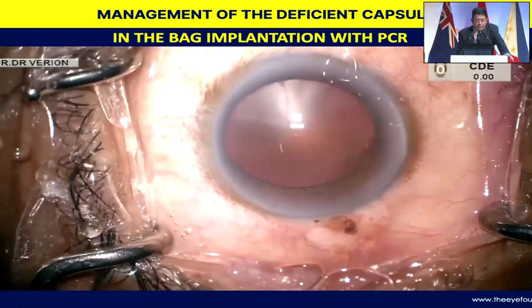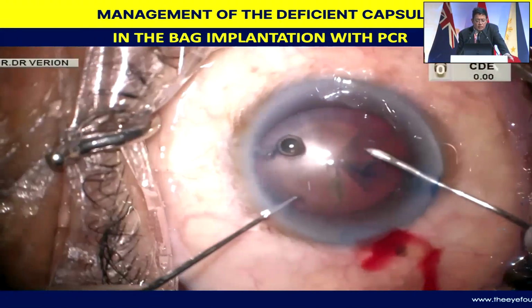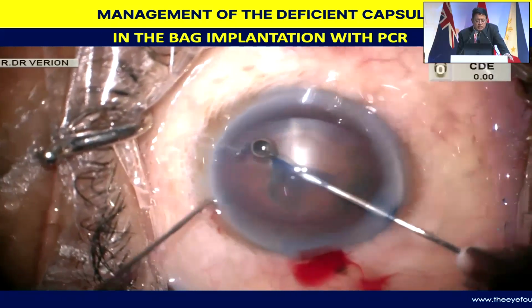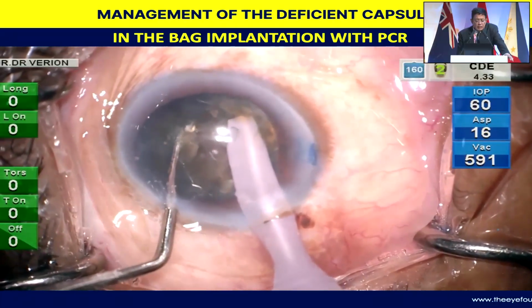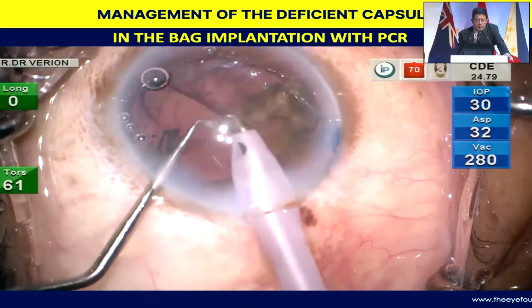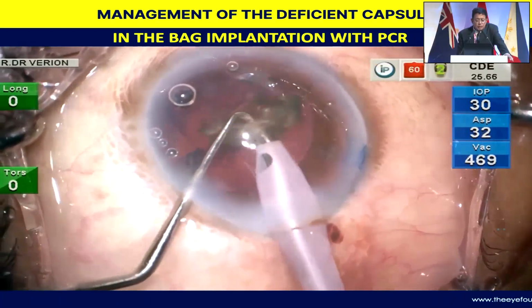In the bag implantation with PCR, you can see all these videos are running at 2x speed. So that's the reason it's a little jumpy. A little hard cataract, basically what I'm doing is a direct chop. And all the maneuvers seem to be going quite well. My phaco probe remains steadily in the center. The nucleus fragments are flowing in.